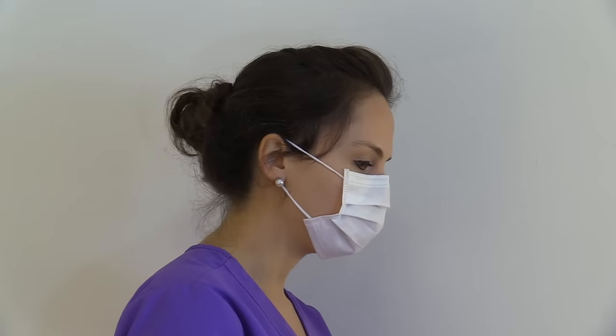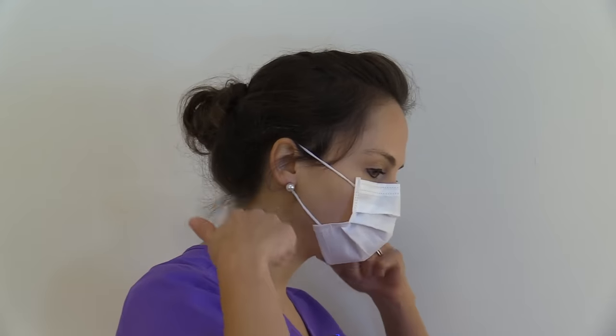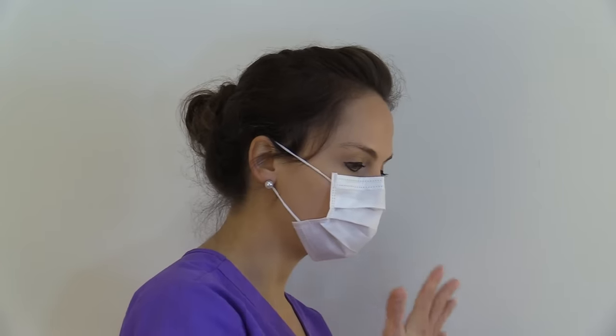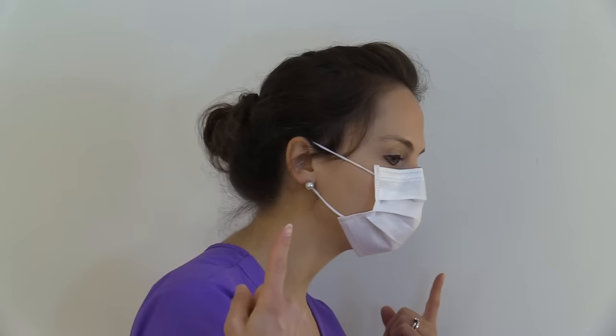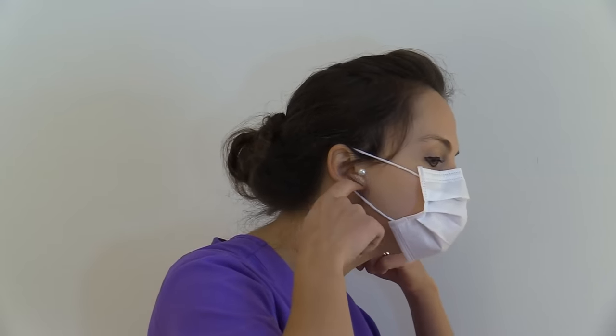Then we are going to remove our mask. Remember, the straps of the mask are clean, but the front is contaminated so we cannot touch that. So we will take both fingers, remove the straps of the mask, and then discard.